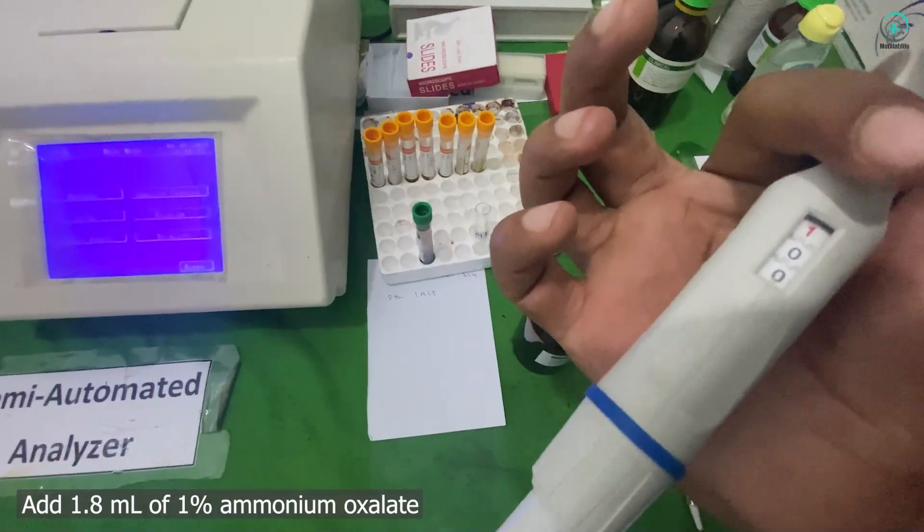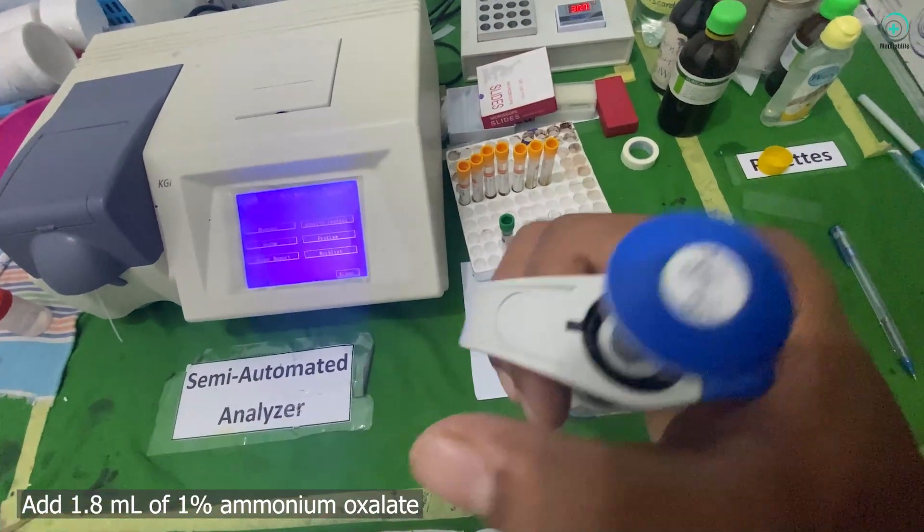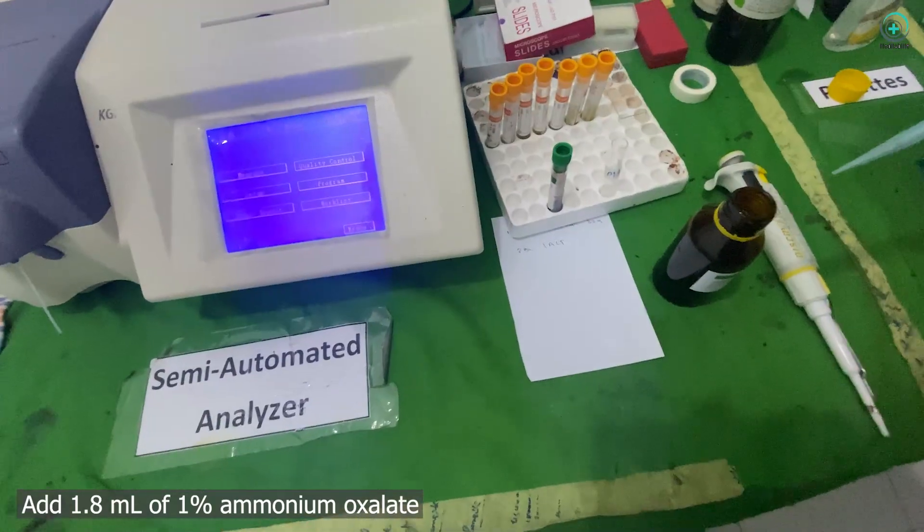Step 1: Ammonium oxalate treatment. Next, we add 1.8 milliliters of a 1% ammonium oxalate solution to the sample.